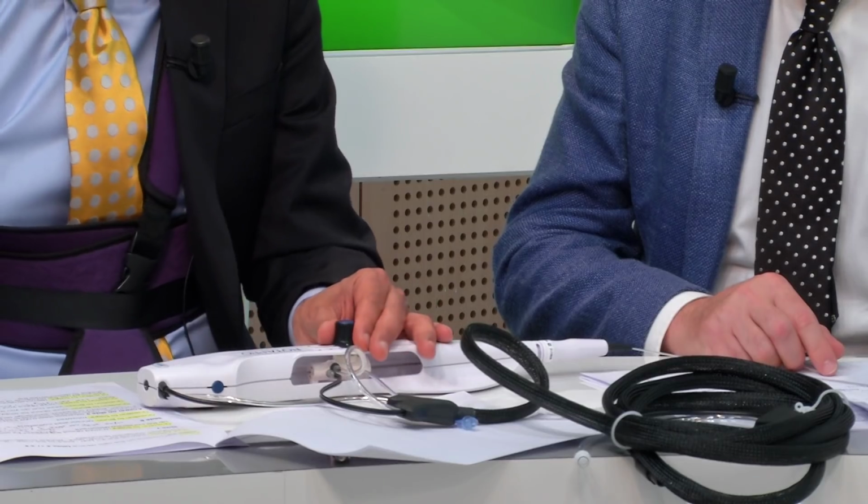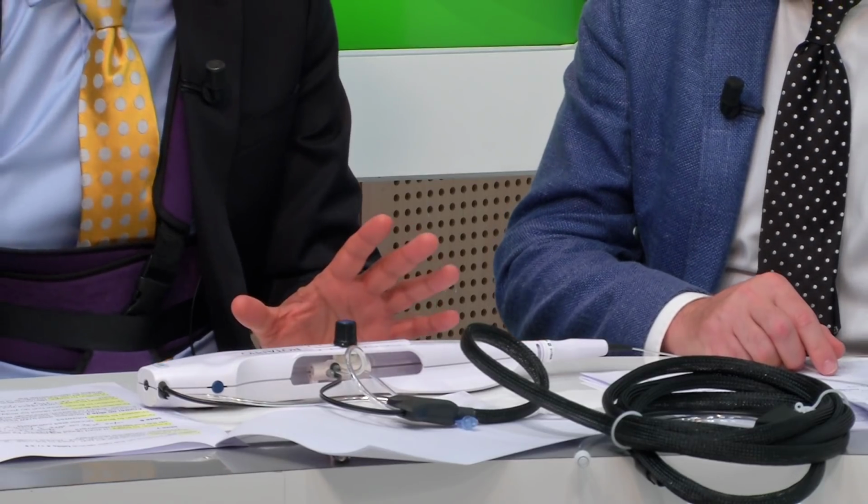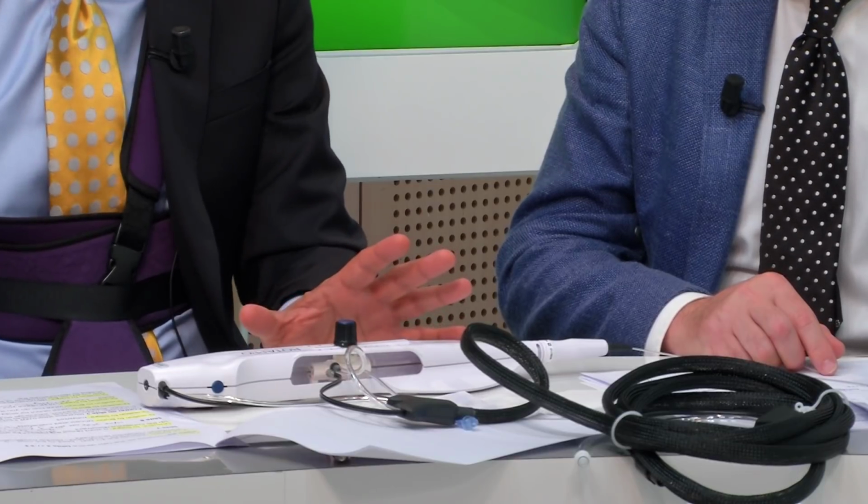There was a European paper of 400 cases where they had an incidence of burr stuck of about 1% and managed all of them percutaneously. I have to say, we have never, in our history of our rotablation experience at our centre, ever had to send anyone to surgery. We've always retrieved them percutaneously.